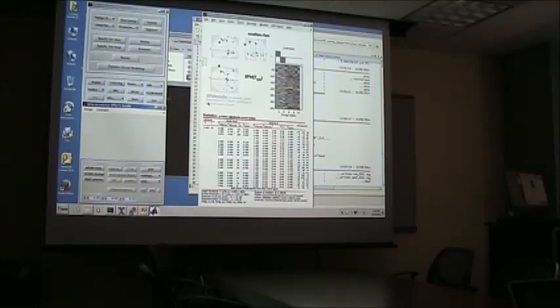Why is it more likely to be significant at the cluster level? It's usually a little bit more sensitive. Your alpha's lower? Yeah, you set this alpha threshold. Isn't peak a single voxel? Yeah, so you have to correct so much more for the number of peaks there are. It's not using any spatial extent. Because with cluster level, your initial threshold is lower than at the voxel level.